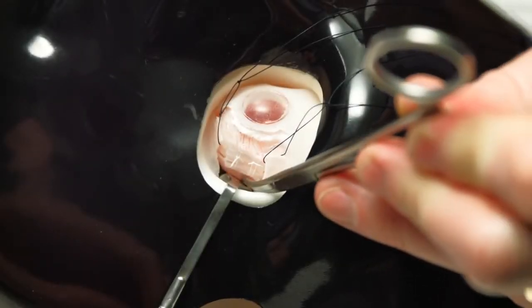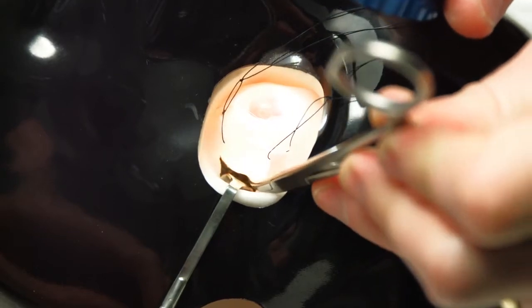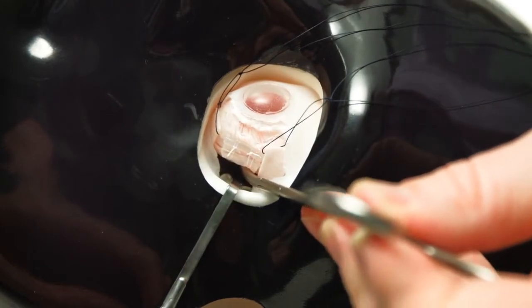In this clip we show how to drain subretinal fluid. A curved artery clip is used to visualize where the subretinal fluid is deepest by indenting posterior to the buckle and observing with an indirect ophthalmoscope.